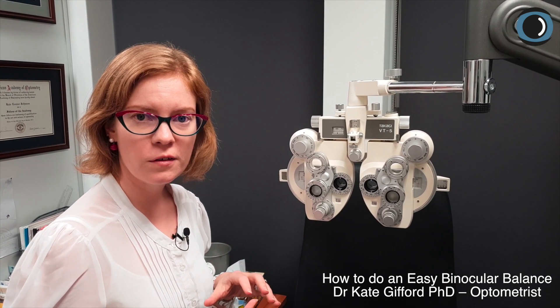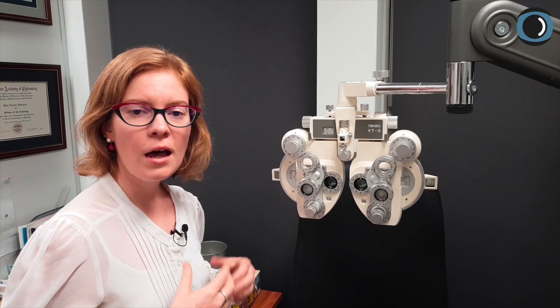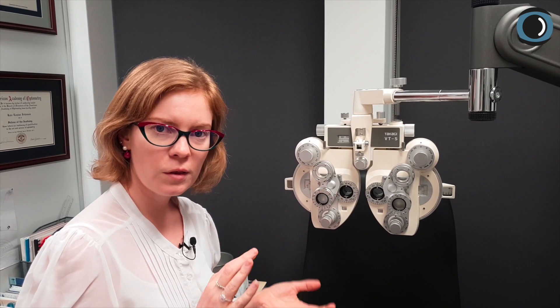This short video shows a technique for binocular balance that you may find a little easier to put into practice, and that your patient should find a little easier as well. As with a video on astigmatic corrections, the key message is to give your patients a difference to see — to make it simple by showing them a difference. With this binocular balance technique, we're going to see if we're balanced within plus 0.25 by giving the patient a difference to see.